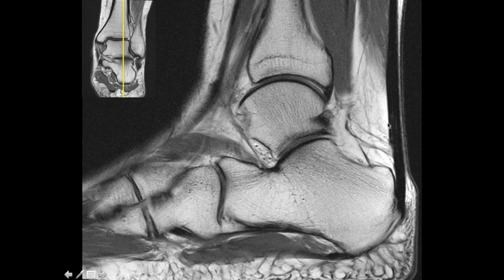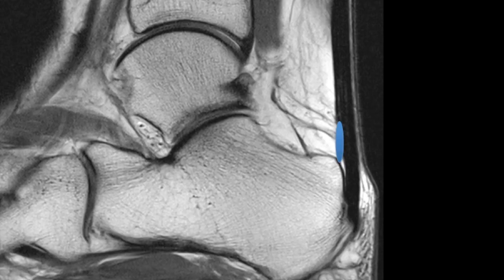The second important structure is this thick tendon that goes and attaches to the posterior aspect of the calcaneum — the Achilles tendon — and the adjoining muscle is the soleus. Always look for any osseous bump in the calcaneum in this region which would indicate a Haglund deformity. There is a small retrocalcaneal bursa in this region; a thin sliver of fluid within the bursa is normal, but a significant amount of fluid would indicate pathology.